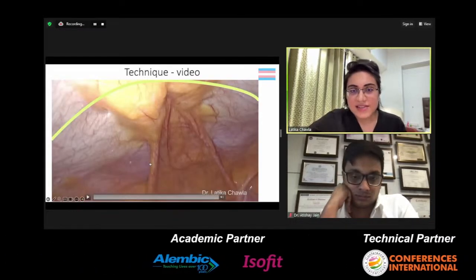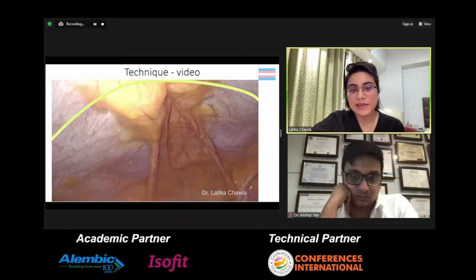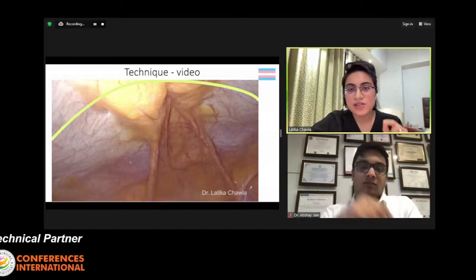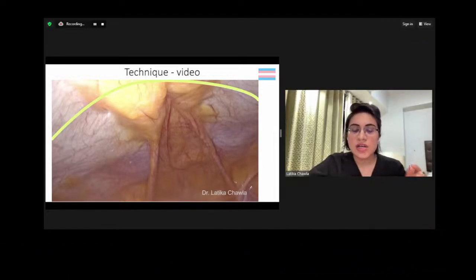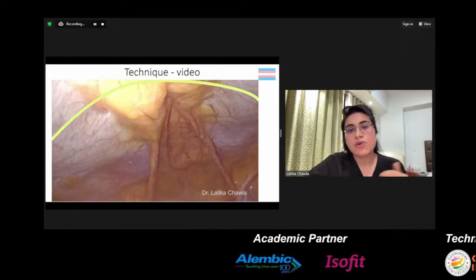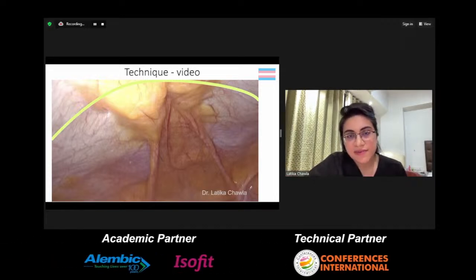I have tried to condense the video and I'm going to try to stop at some key points so that we can discuss them at length. As you can see in the beginning, I've marked my incision. So the first step is to mark the incision. Usually where you mark your incision will depend upon the length of the lower segment, that is the distance between the umbilicus to the pubic symphysis.